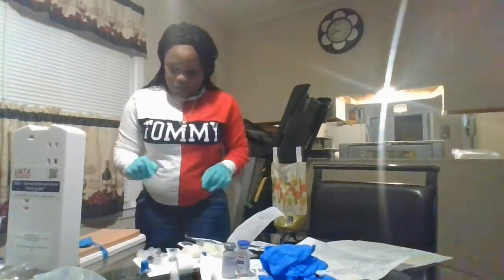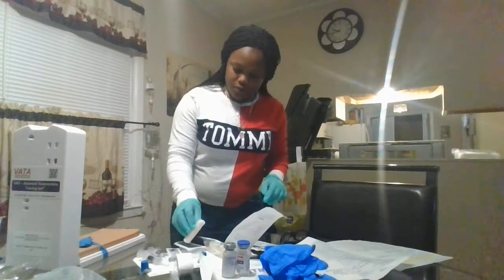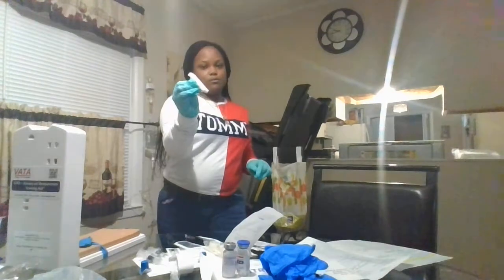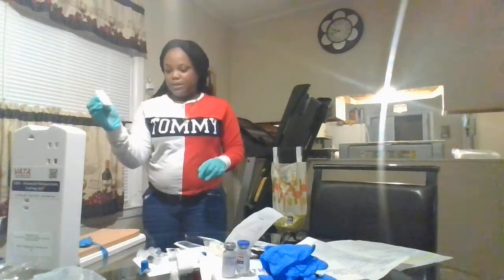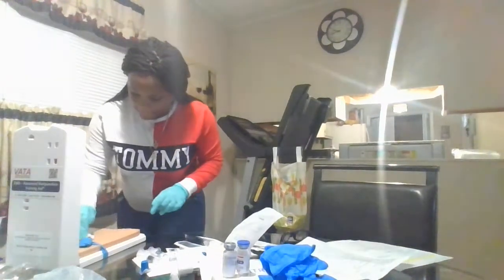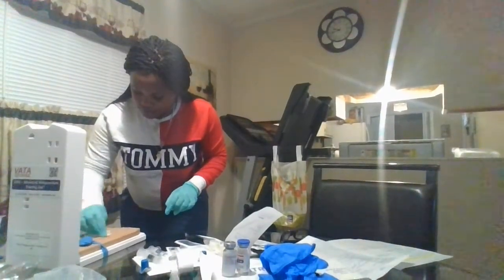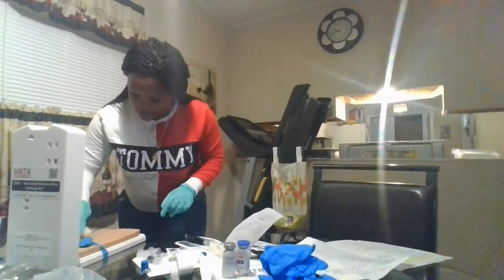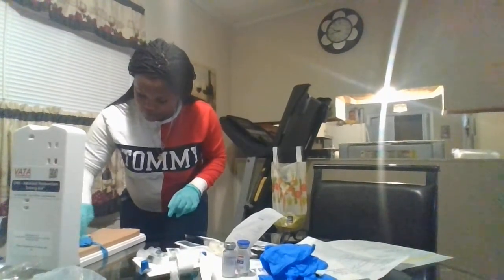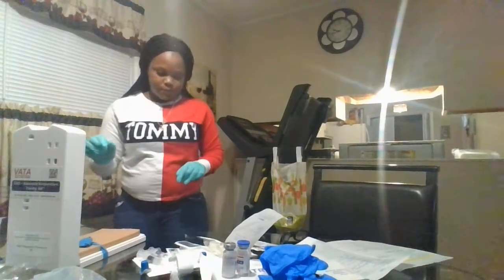Alrighty. You're going to clean your site to make sure we remove all germs. And we're going to clean for 30 seconds in a circular motion. Okay.